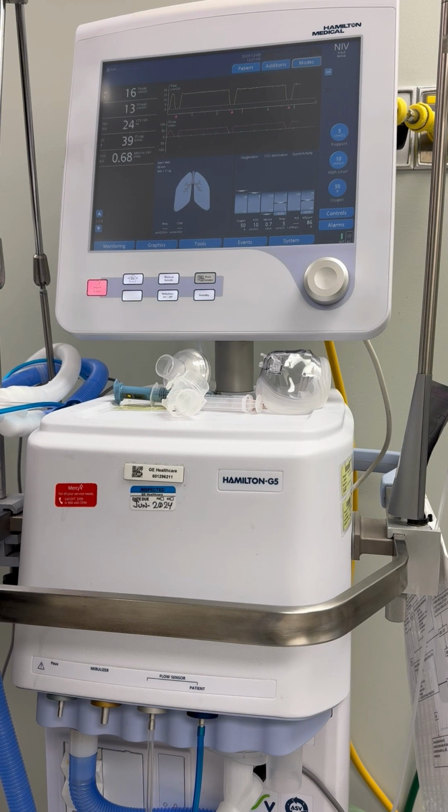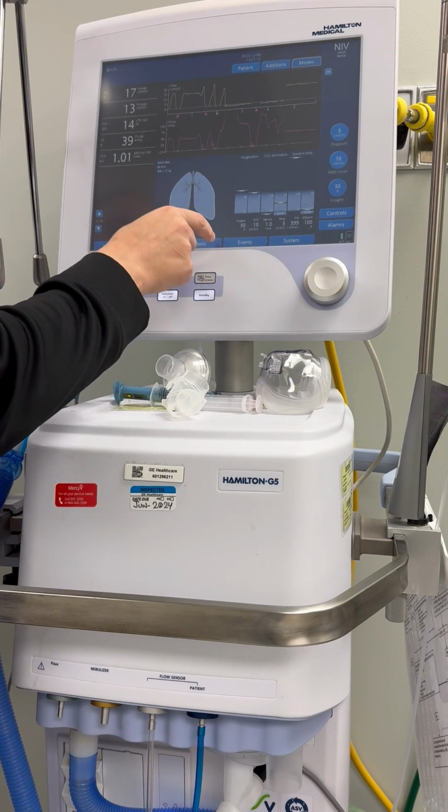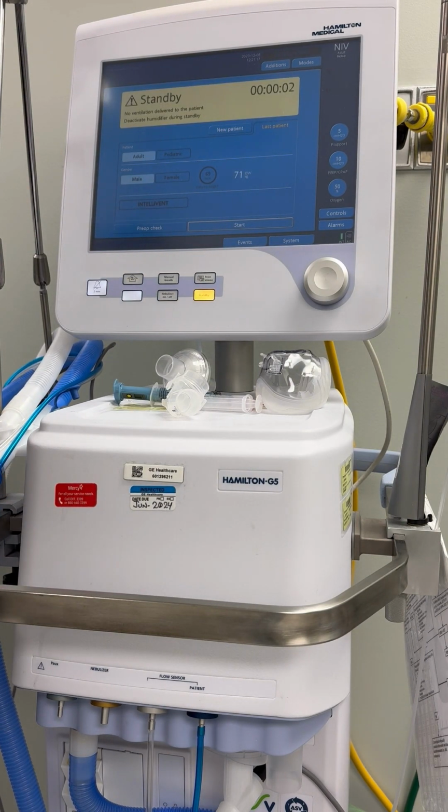You can see your exhale tidal volume, your peak pressures, respiratory rate, and see how many breaths the patient has actually triggered. So let's go ahead and place it back in standby here. I just had the mask held up to my hand just to give you guys a little bit of a waveform here to see. Okay, so let's talk about NIV ST.